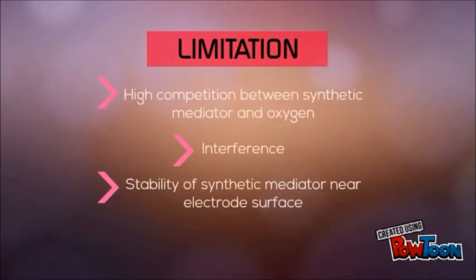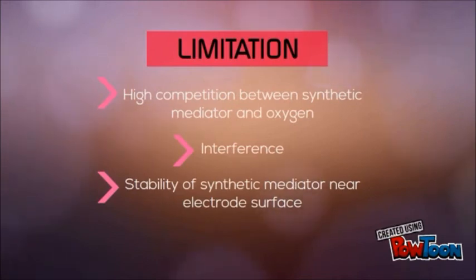However, there are major drawbacks of using a mediator in second generation glucose biosensors: high competition between synthetic mediator and oxygen, interference, and stability of the synthetic mediator near the electrode surface.